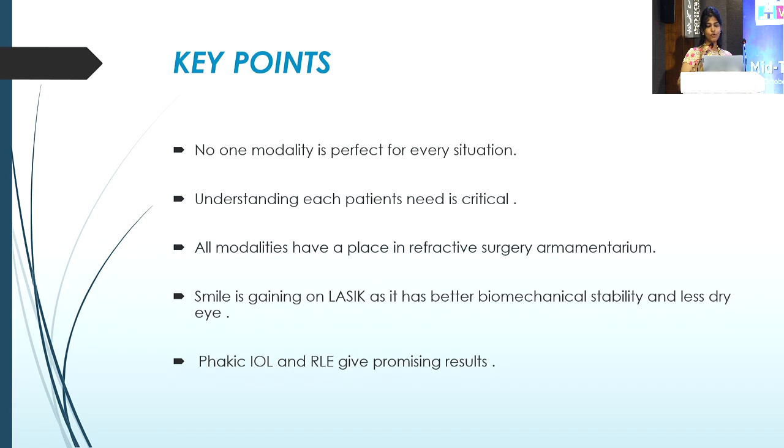Coming to my last slide, no one modality is perfect for every situation. Understanding each patient's need is critical. All modalities have a place in the refractive surgery armamentarium, so we have to take into consideration the patient's needs, the occupation of the patient, and the patient's expectations. Patient expectations play a very important role in refractive surgery, and SMILE is gaining on LASIK as it has better biomechanical stability and less dry eye.